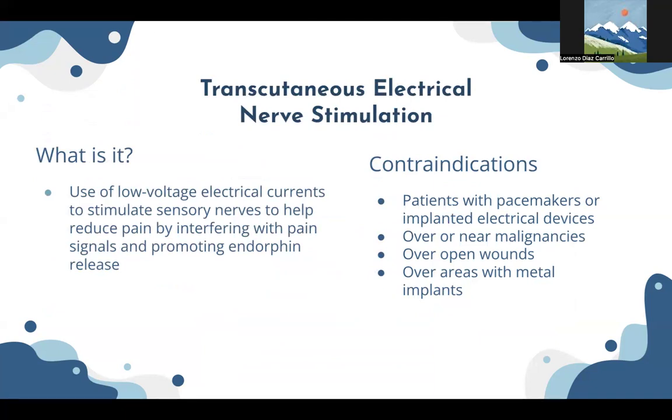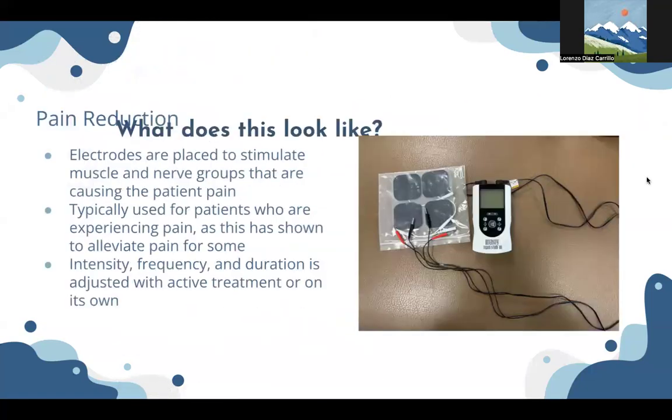The contraindications for this one, again, very similar to the last when you're dealing with electricity: patients with pacemakers, over implanted electrical devices, over or near malignancies, wounds, and metal implants. Now let's take a look at what this looks like.